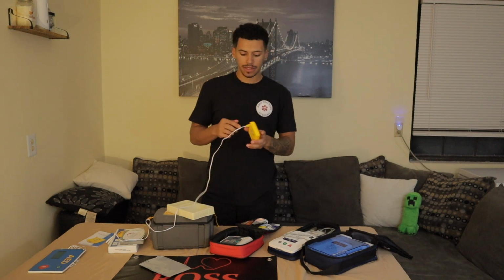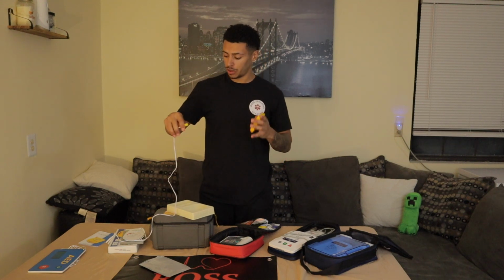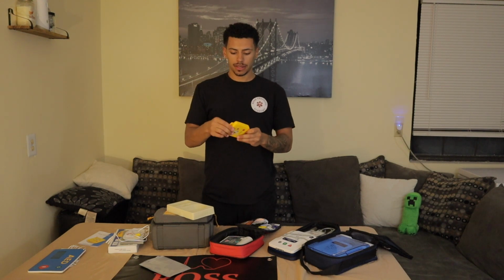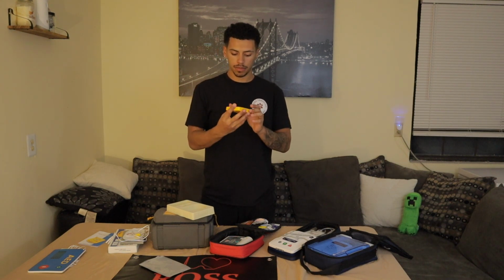And that's about it. It has a little metronome in there, so it'll still keep that rate of about 100 to 120 chest compressions a minute. But that's all this thing does. It takes 2 AAA batteries right on the back side, and that's it. It doesn't take a whole lot. Something easy to travel with.